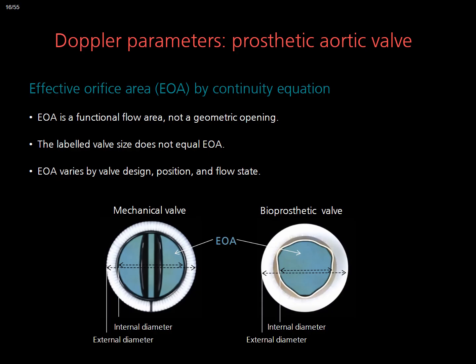If the LVOT measurement is uncertain, do not force an EOA. Use the Doppler velocity index and, above all, compare with the baseline post-operative study.